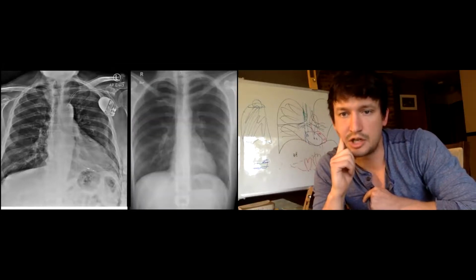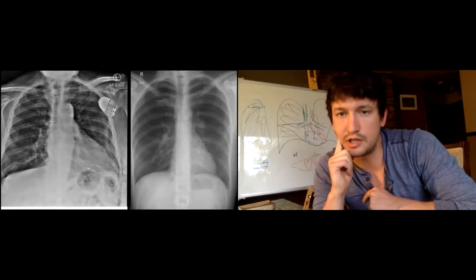You can compare and contrast to the right picture, where at the right apical portion of the lung, you see no vascular lung markings, and you see a very thin pleural line. Notice how thin it is compared to the left. And it doesn't go across to the other side. Next slide.